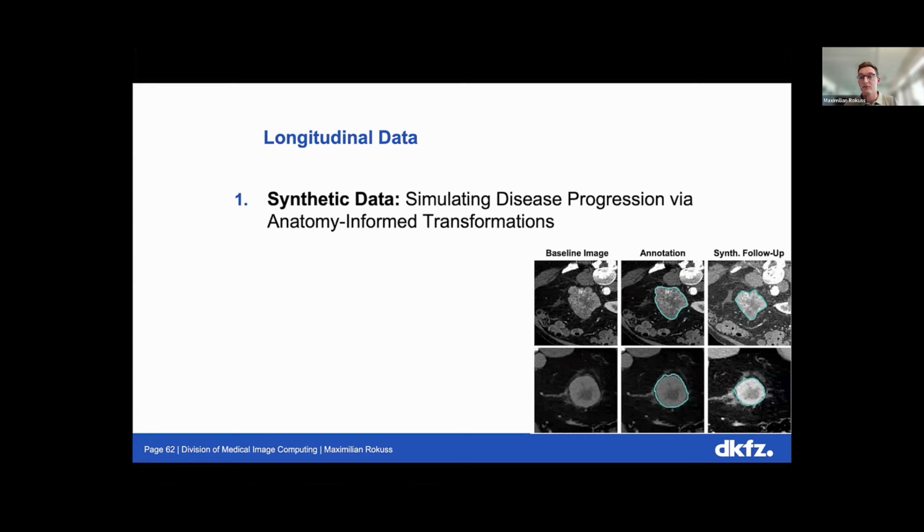The second thing is then we, of course, need to really evaluate our model properly. So we also annotated a real data set in-house at the DKFZ, with real patients which were processed here and which were also annotated, I think, at 4 different time points.